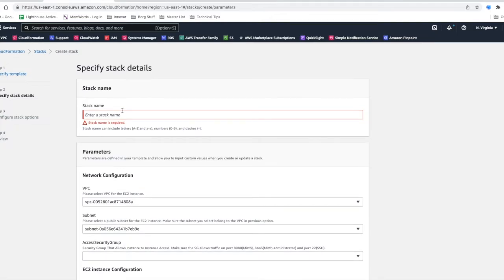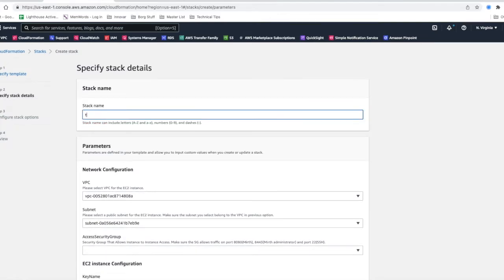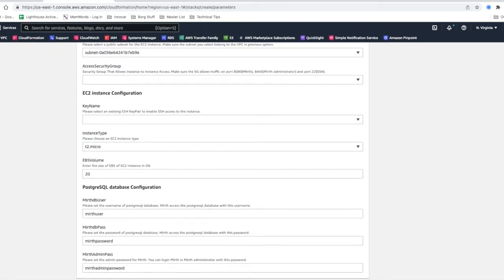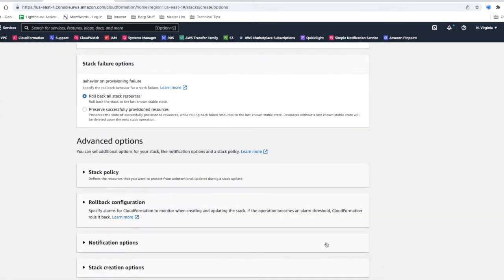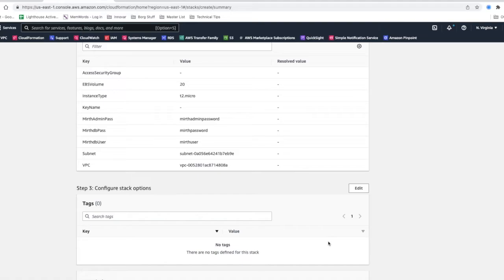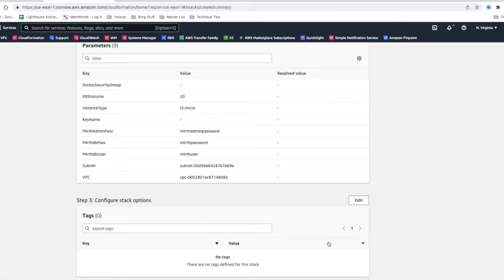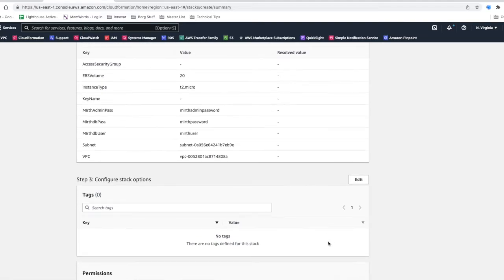So it's pretty easy to do and you can have it up and ready in a couple of minutes and you'll have a working MIRTH Connect environment.